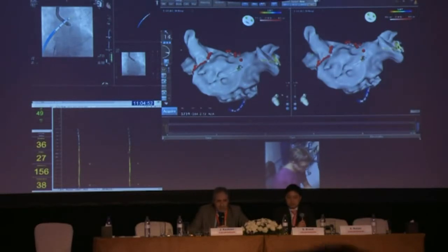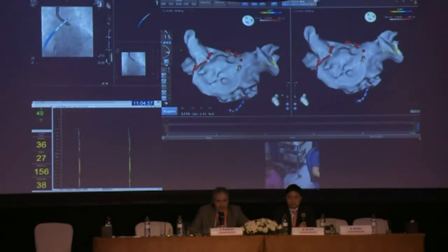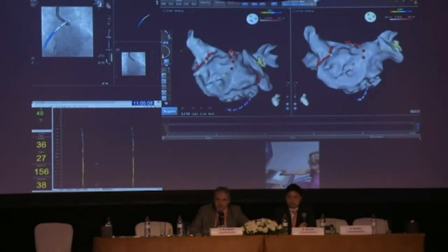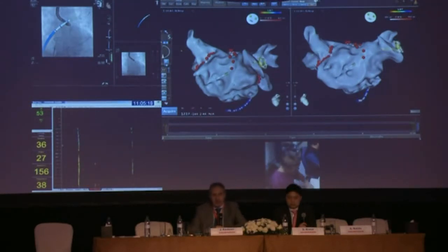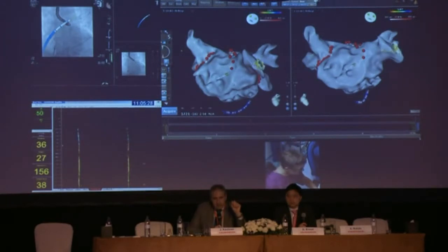But anyway, now you have sinus rhythm. So how will you continue? Will you do some line in the roof or in the coronary sinus, some ablation, or what will be the strategy now? So my strategy is to do nothing more. I'm going to check the veins and make sure they're isolated. But I'm a real believer that the more you do, the more substrate you create. We've ablated him to sinus rhythm, so we've hit the substrate that's relevant on the day. And I think the likeliest reason for recurrence is either reconnection of the veins or failure of one of the lesions that I've done, the CFE. And I really don't want to add anything more to him now.